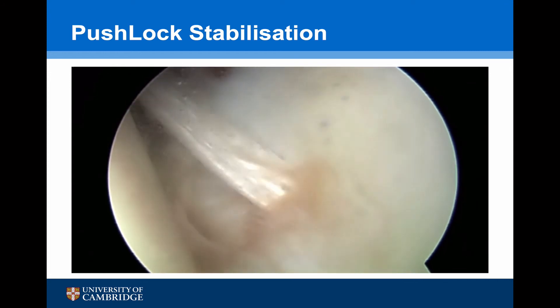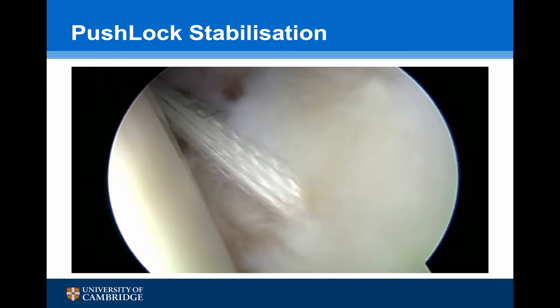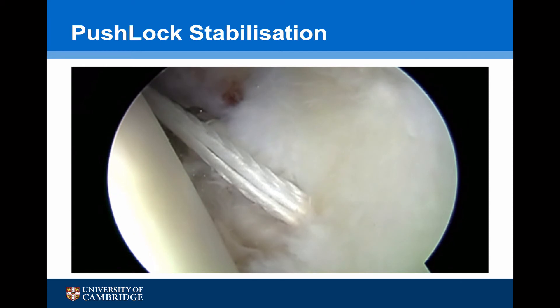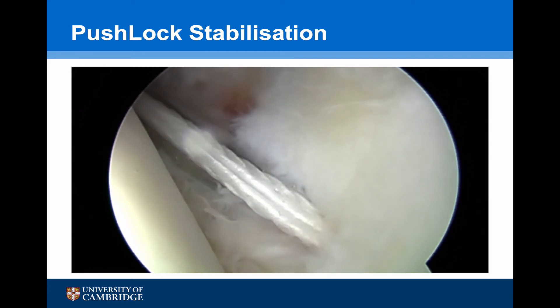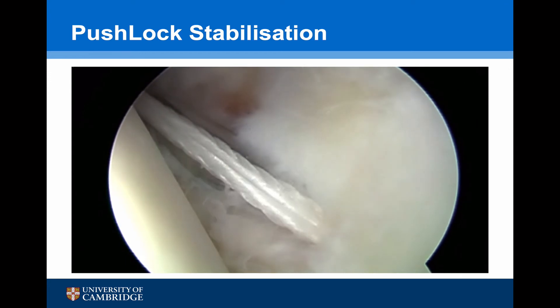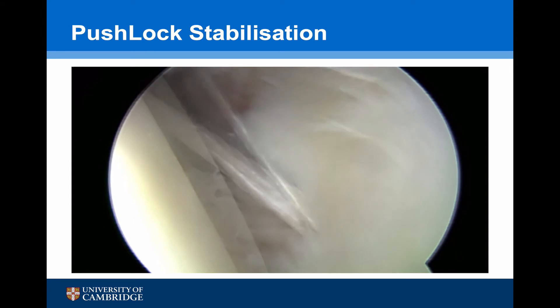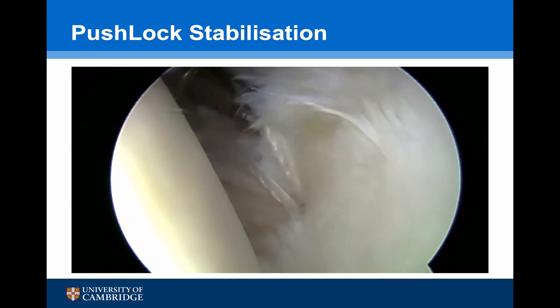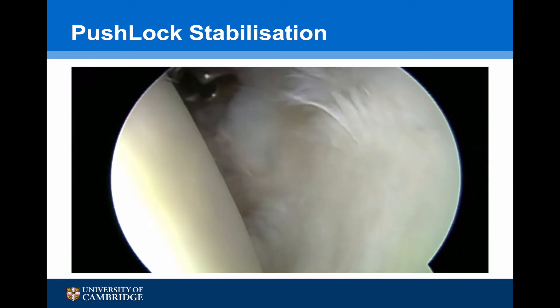The eyelet is at the bottom of the socket. We take the orange cap off now, and the anchor itself is knocked into position just below the level of the glenoid bone. The introducer is then unscrewed and detached, and we use the tape cutter to get a flush cut of the tape.